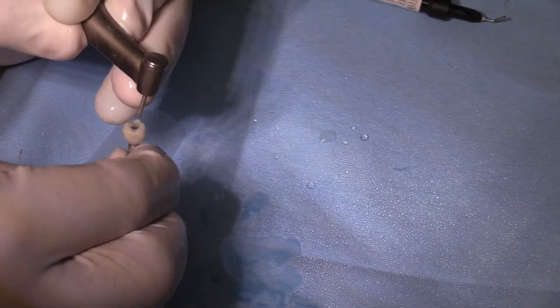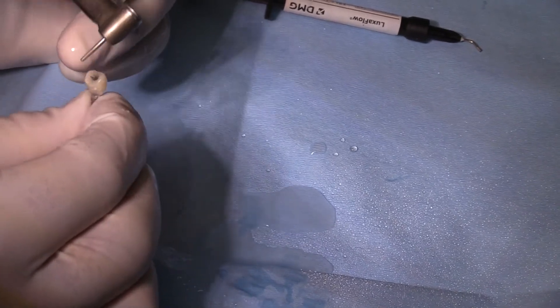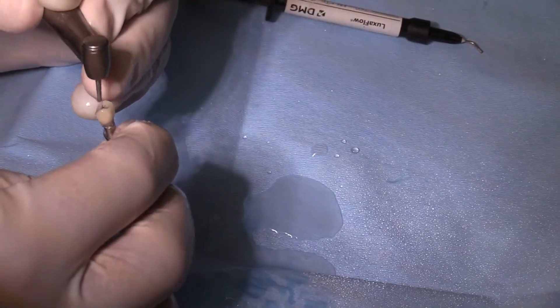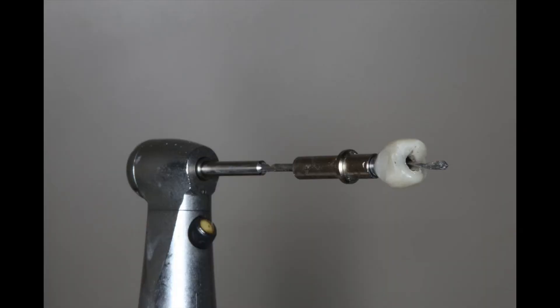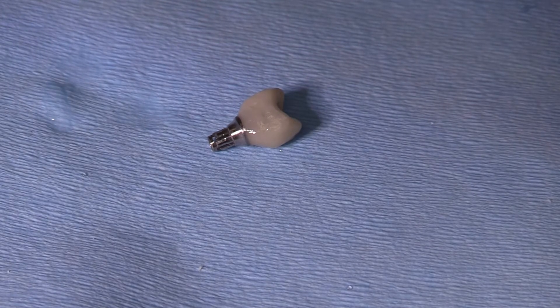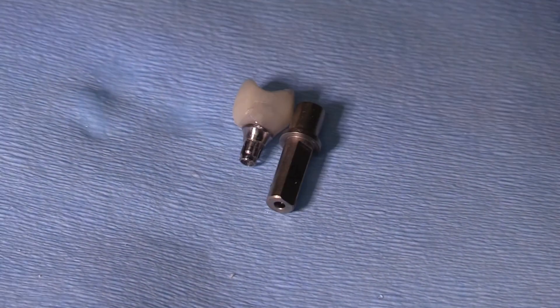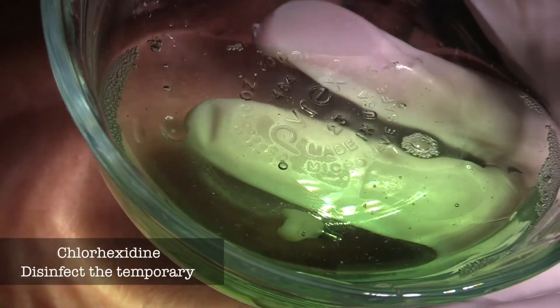We actually used a TRIO scanner to pick this up, so we were able to capture the shade and color with the intraoral scanner. There's a lot of digital workflow on this case, and we usually show how this all integrates together during our live courses — it's really fabulous. You'll see how the drill goes through the analog abutment and also the crown itself, enabling you to put the screw back in the other way. It's kind of reverse architecture, but a very cool concept.